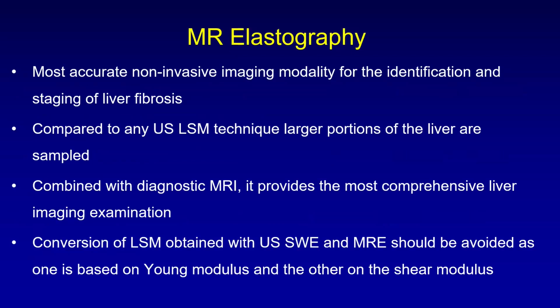But we need to remember that we should not try to extrapolate the LSM values that we get with ultrasound shear wave elastography and match them with MR elastography, because the ways of arriving at the LSM scores are different in the two modalities. One is based on the Young modulus and the other is based on the shear modulus.